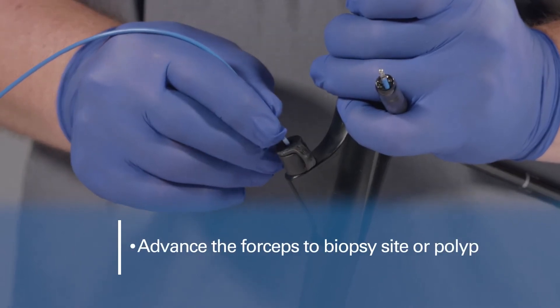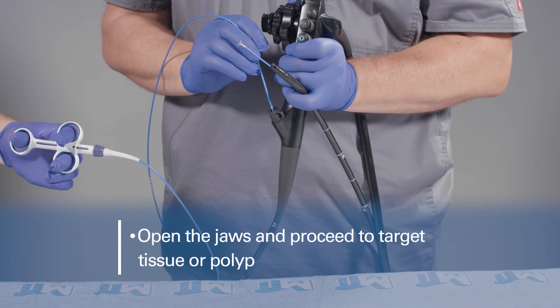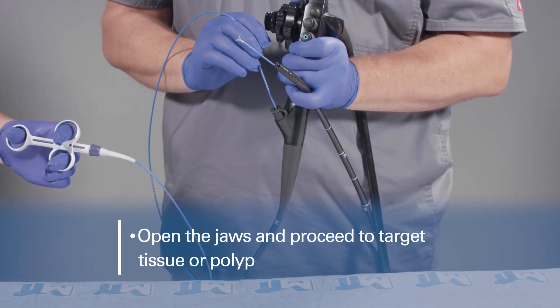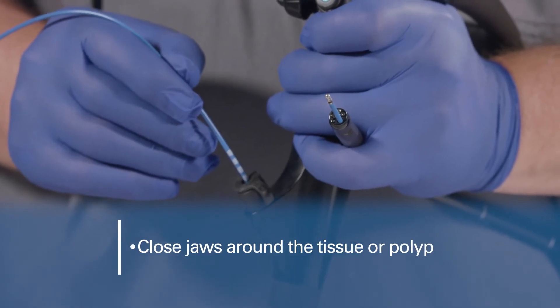Advance the forceps to the desired biopsy site or polyp. Open the jaws and proceed to advance onto the target tissue or polyp. Using slight pressure on the handle, close the forceps around the tissue or polyp.